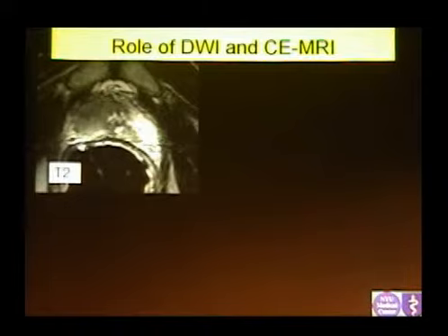So you can use contrast either as regular contrast with multiple time points, looking at the enhancement, but more sophisticated techniques can use perfusion imaging, and you can use some kind of models where you can get perfusion parameters, very complex, that you can use also to identify tumors and also look for any changes after treatment.